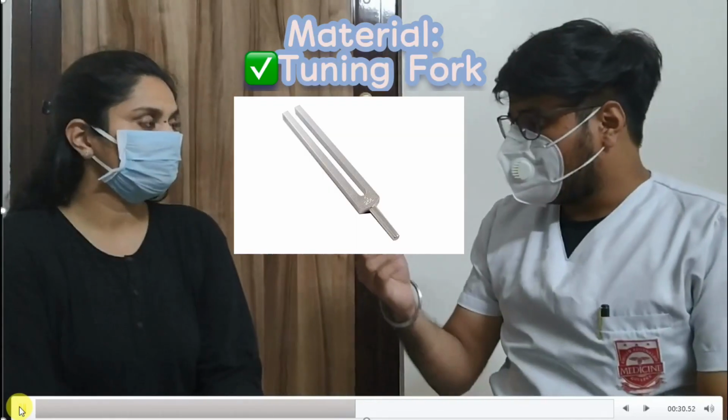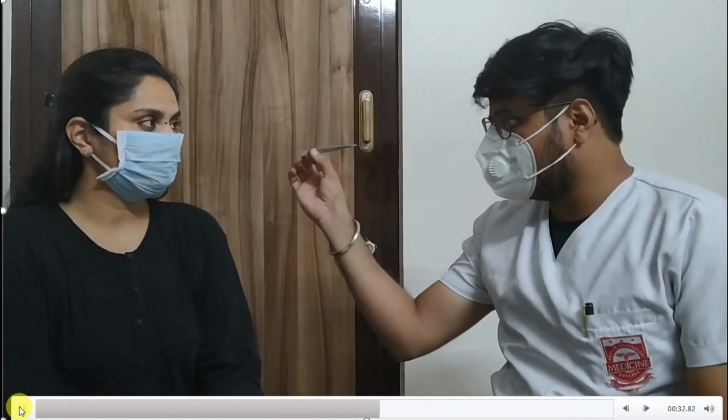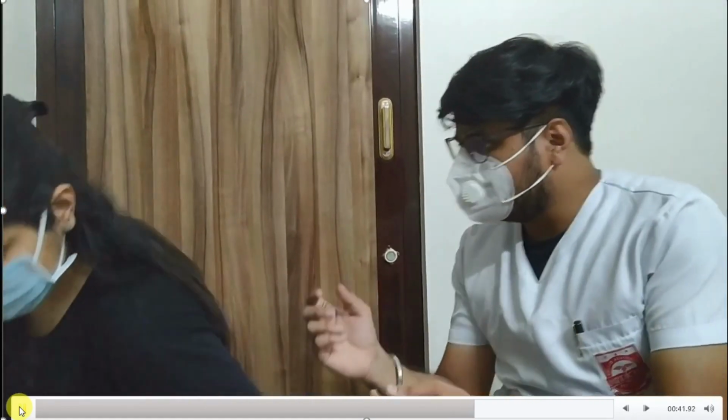Hello sir, my name is Preeti Sabharwal and I have had some hearing issue since the last 2 or 3 months. That's why I am coming here. Okay, so Miss Preeti, since you have had hearing problems for the last few months, I am going to conduct a test called Schwabach's test, in which I am going to use this tuning fork. I will place this tuning fork behind your ears, and when you stop hearing the sound, just raise your finger, so I will proceed further, okay? Okay sir. Okay, so can you turn to that side? Yeah, okay.